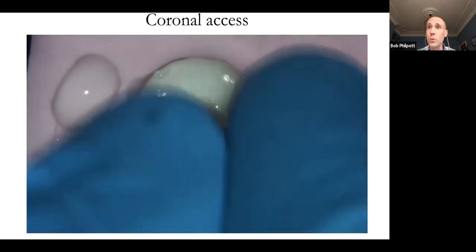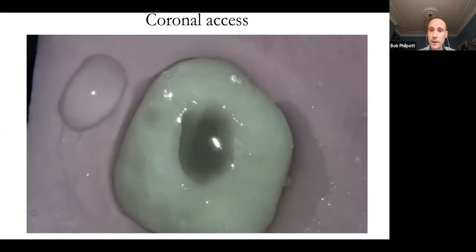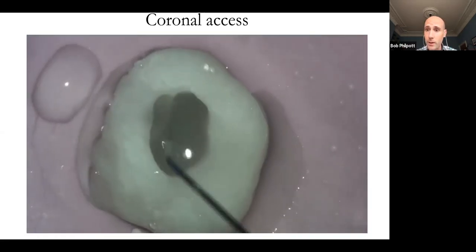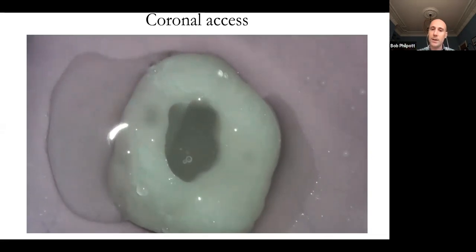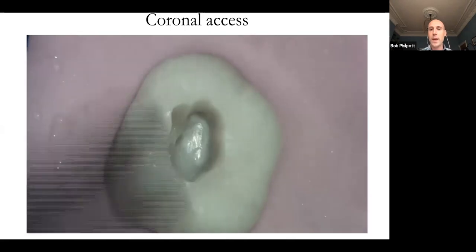And even if you do, in that straight coronal part of the canal, if you've created a glide path, you'll get it back out again. So you want the instrument to be engaging and kind of binding slightly, and you'll see the head of it shaking ever so slightly as well.